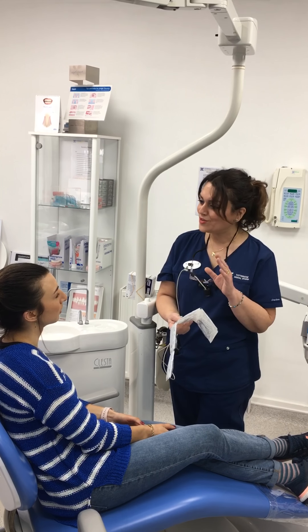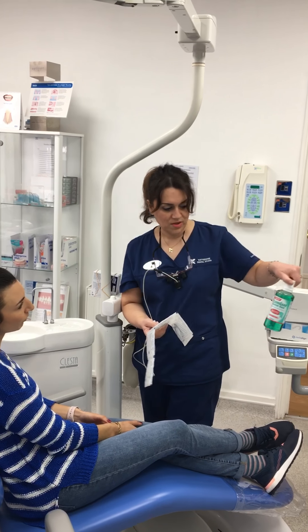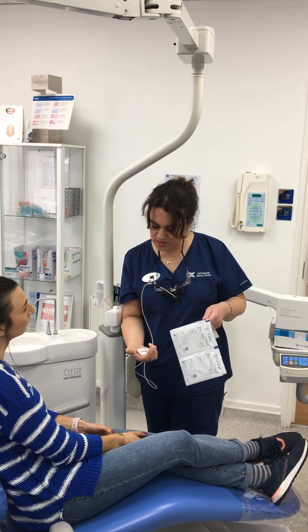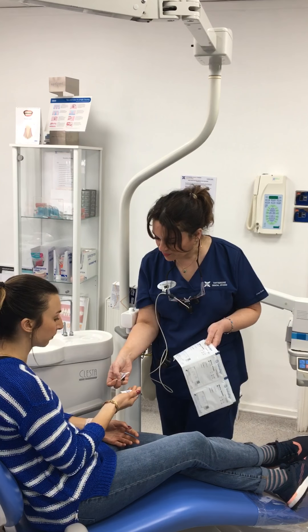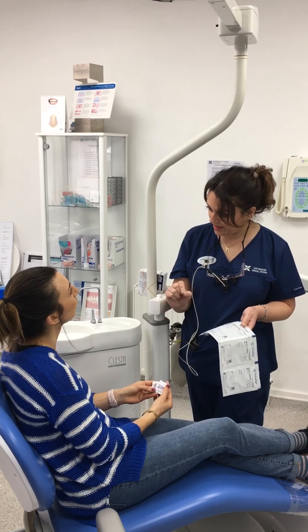Very important that you keep your teeth clean and you use a mouthwash. I would recommend a fluoride mouthwash. And I'm also going to give you some of this — it's Retainer Brite, it's a powder — so you can soak your aligners in there and keep them clean.